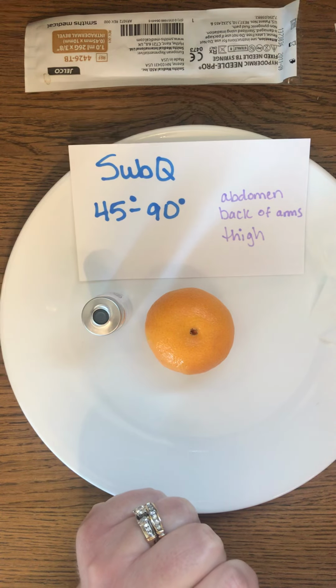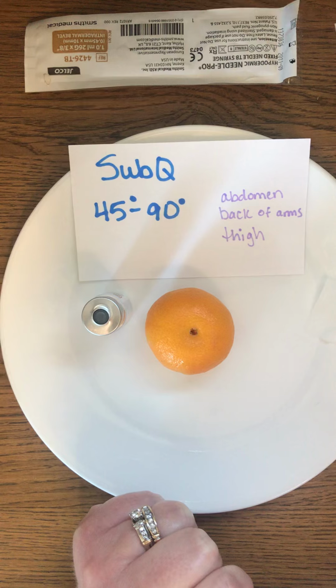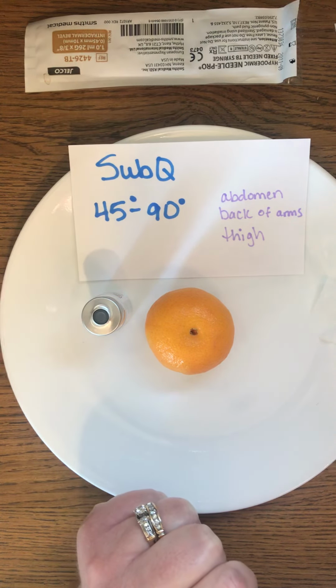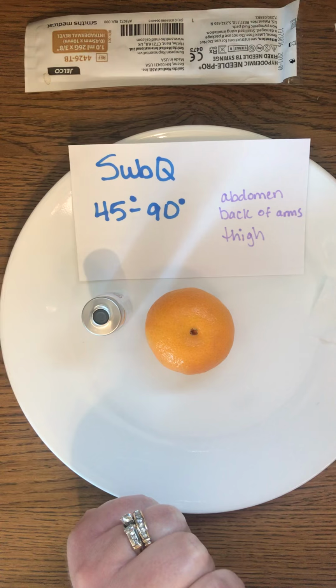So typically the length of the needle, the recommendation is between 1/4 and 5/8 inch long. The gauge of the needle is going to be 25 to 27. And the angle is going to be anywhere between about 45 and 90 degrees. And that's going to depend on the person and the size of the person that you are giving the injection to. It depends on the amount of subcutaneous tissue that they have.